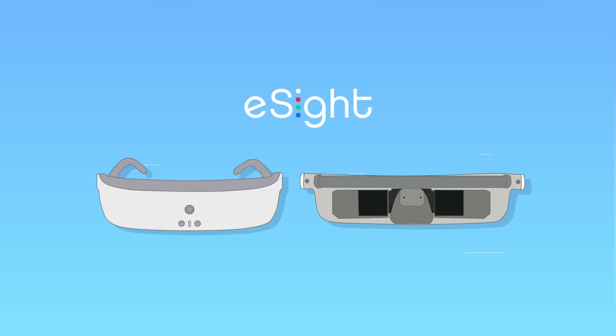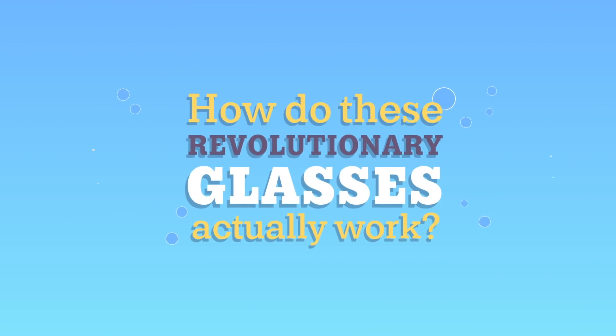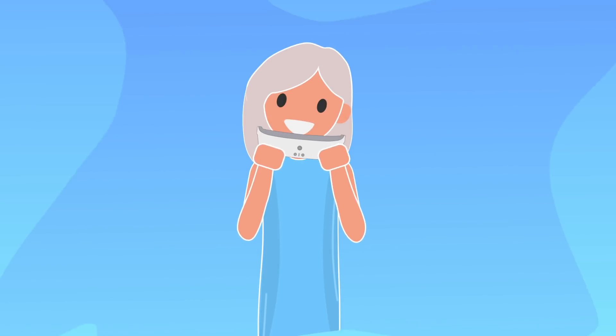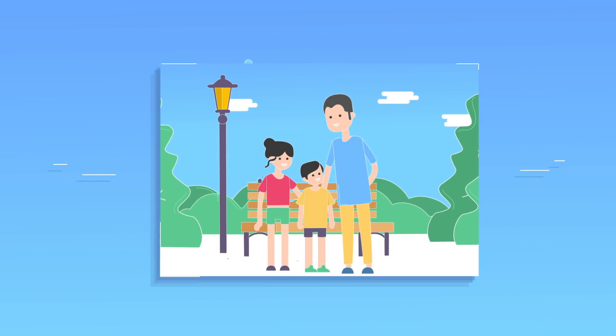eSight is an amazing pair of electronic glasses that help the visually impaired see clearly. You're probably wondering how these revolutionary glasses actually work. First, you power on the glasses by pressing and holding the power button. Put on eSight like you would a normal pair of glasses. Instantly, you'll begin to see what's in front of you in real time.